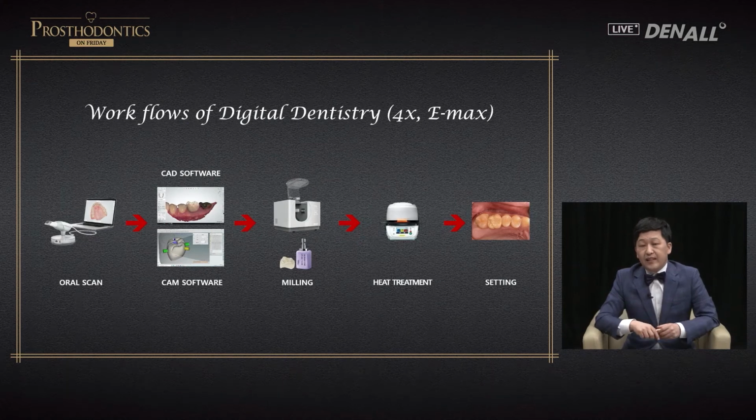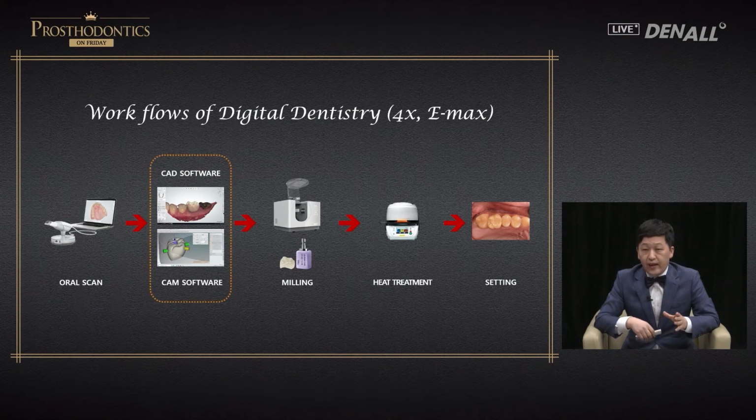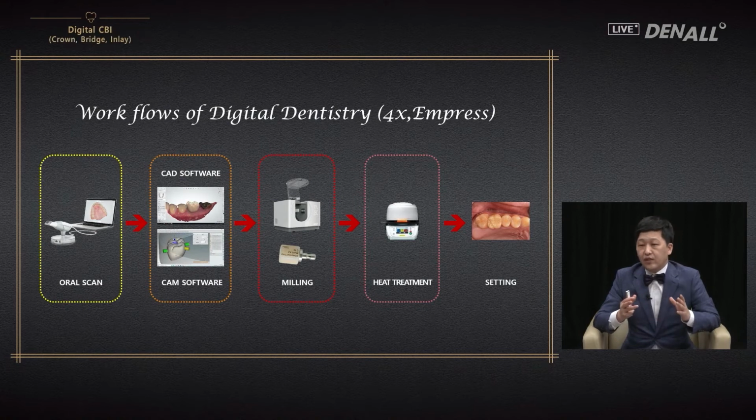First, let's look at a 4-axis milling machine using Emax. This is the workflow using digital dentistry. Oral scanning is done. CAD software is used for design and calculation is done with CAM software. And the block, which is slightly purple, is milled and firing is done.